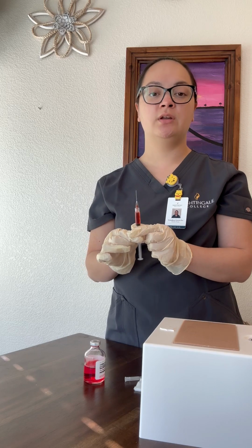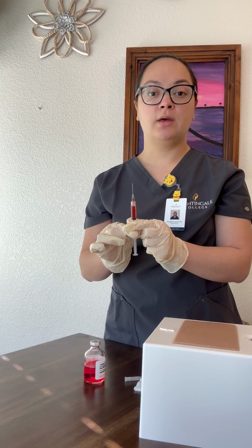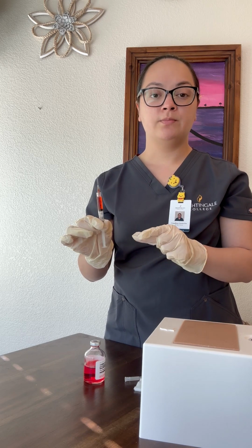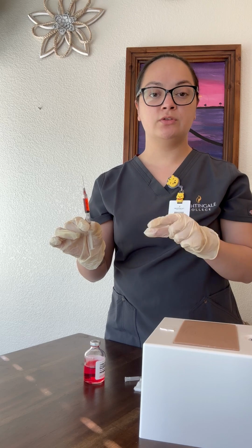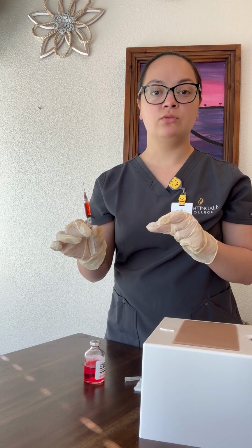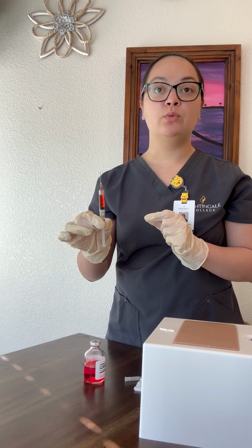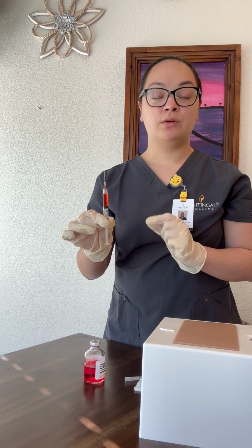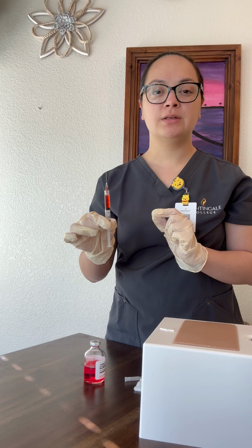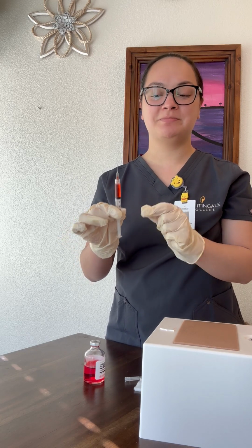So for this injection, we will be inserting it like a dart at a 90-degree angle. We can either use our 2 fingers here to stretch the skin a little bit, or we can gently pinch to provide more muscle area. And we will inject the medication at the rate of 10 seconds per milliliter, or 1 milliliter per 10 seconds.